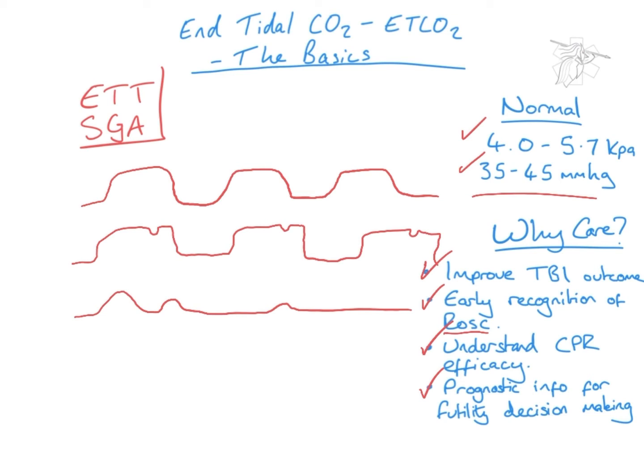And actually, when we talk about accidental esophageal intubation, amongst all the other tools that you'd use to identify that, capnography is generally quite a surefire way of identifying immediately that you've managed to intubate the esophagus rather than the trachea. So they're just a couple of the tools that we can use waveform capnography for, which is this bit here that we've just been looking at.